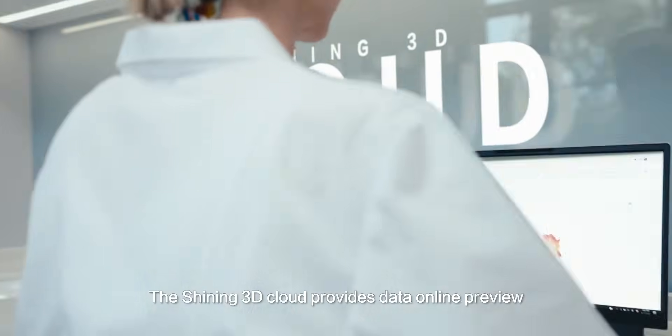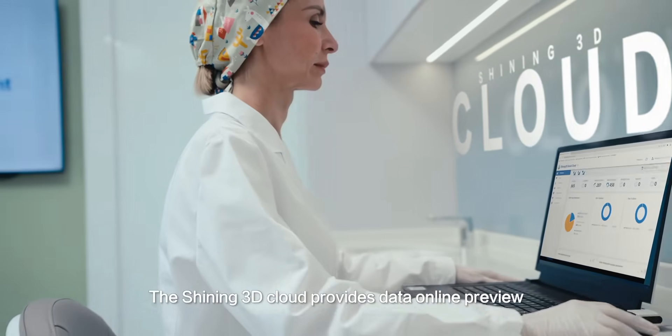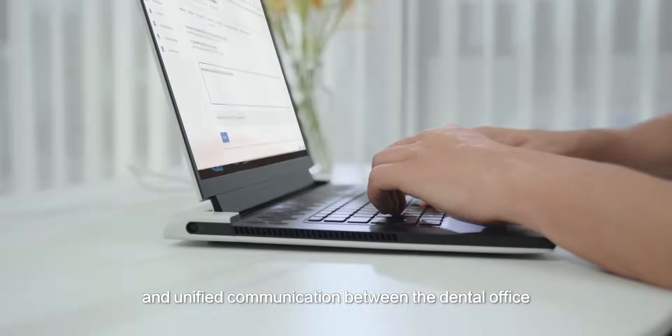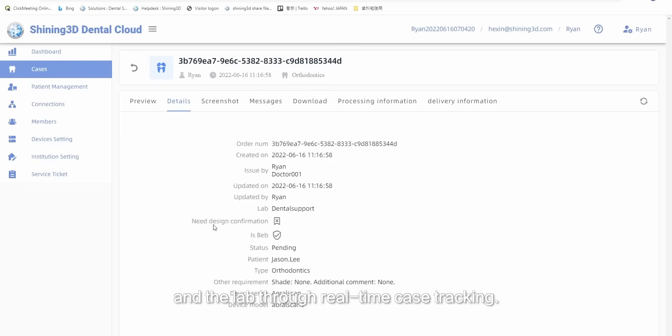The Shining 3D cloud provides data online preview and statistics analysis, and unified communication between the dental office and the lab through real-time case tracking.